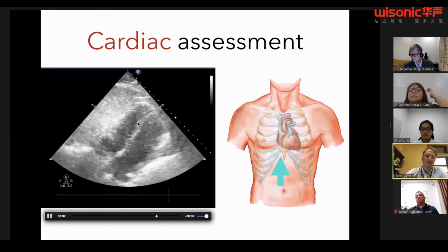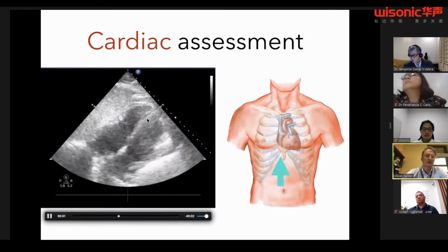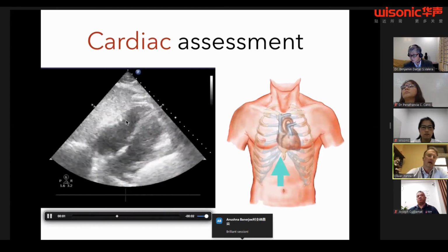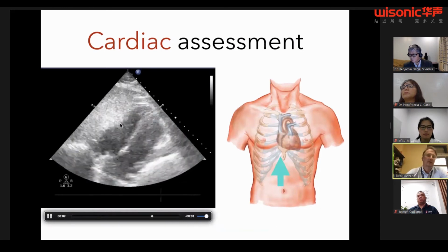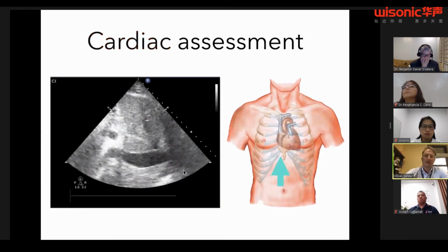And you can see here, this is the right heart. This is the liver on top, the right heart, the right atrium, the left atrium, the left heart. Even if you don't routinely do echo, you can see this seems to be squeezing quite well. What we like to look at is the tricuspid annular ring right here between the atrium and the ventricle. If it moves up and down really well, that is an indicator of good RV function. You can see right there, there's good movement along that area. So there's pretty good biventricular movement in this patient.